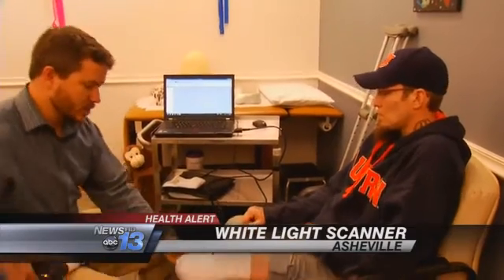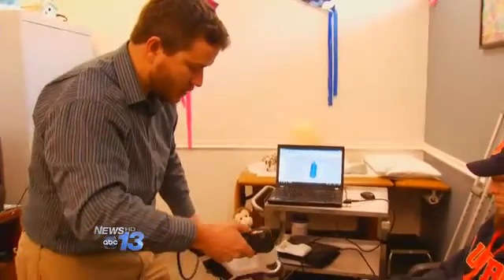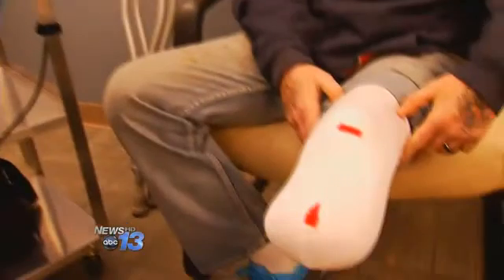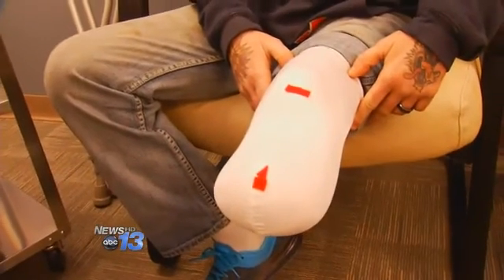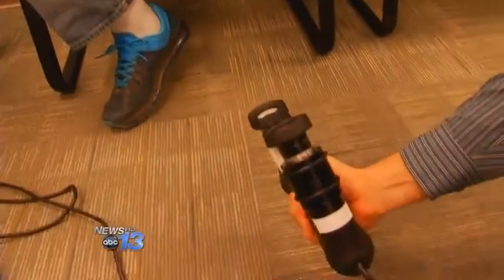A patient's partial left leg gets photographed from every angle with this new scanner. This one uses just a white light — the same white light used in an average camera — so it's very safe. The new computer technology at Care Partners in Asheville captures every detail of Ben Hall's leg.